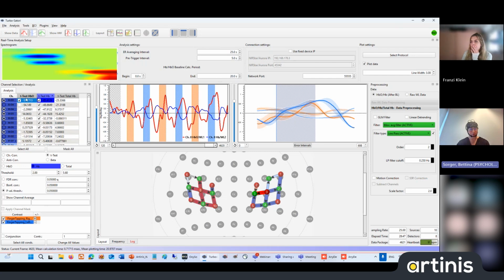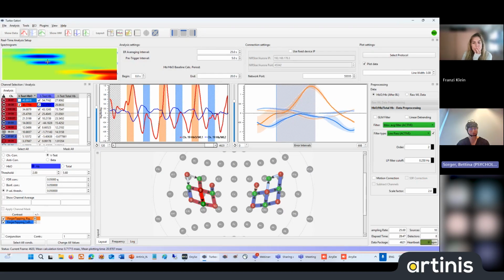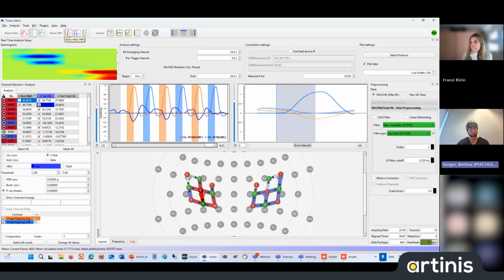Yes. What else? Maybe when we go back here, you could in principle also display what would be the optimal hemodynamic response, what we would expect, which is now blue, but we of course compared here to the red curve, is very close. I can also maybe switch off for now the oxygenated values, and you see only the deoxygenated values, and also here the reference function, that would be the case in the optimal case. So we are very close to what you actually can achieve or theoretically should achieve.